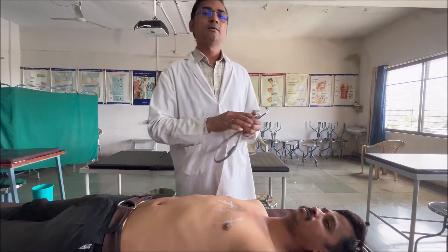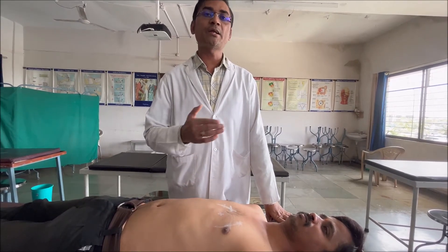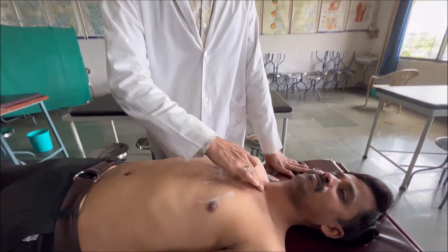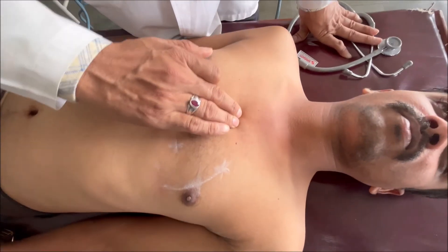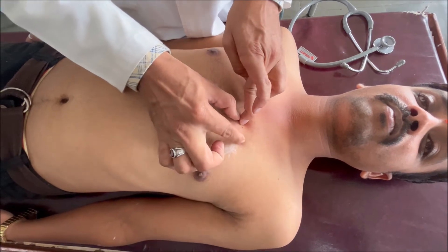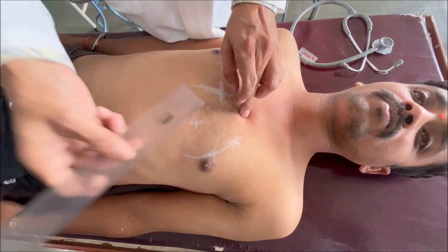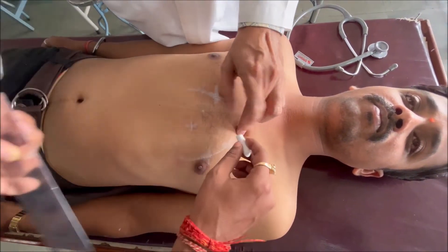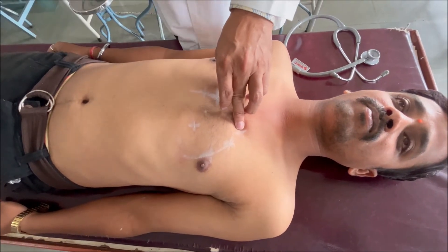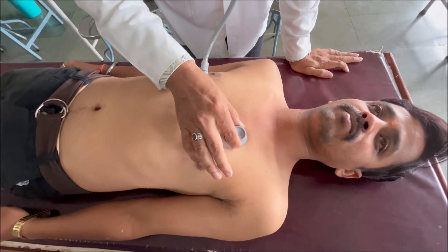Now coming to the auscultation of the pulmonary area. The pulmonary area is located on the left side, 2 cm away from the left border of the sternum. From the sternal angle, identify the second rib and the second intercostal space — approximately 2 cm from the sternal border. You can use a ruler to find out the 2 cm distance. Place the stethoscope directly over this area and listen to the heart sound.